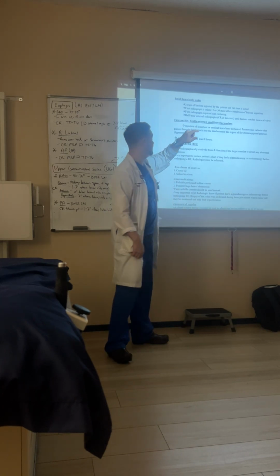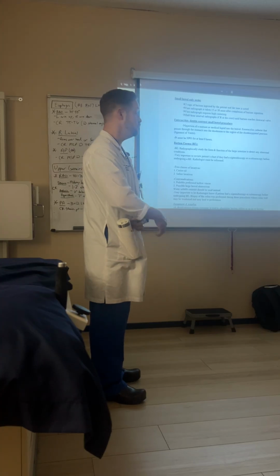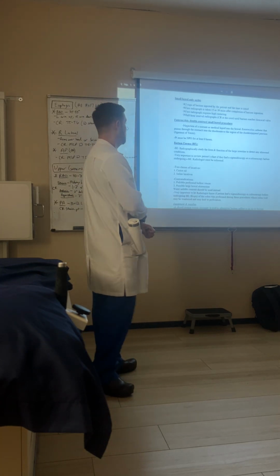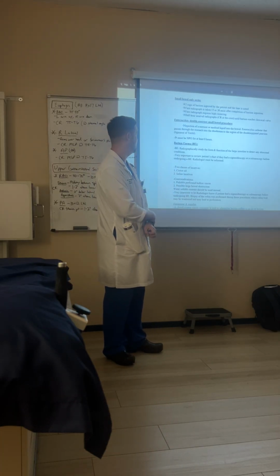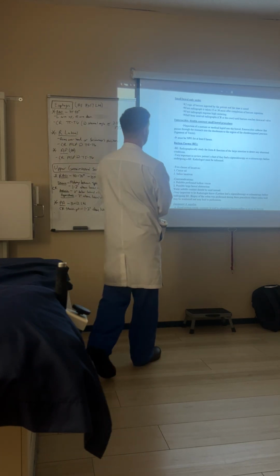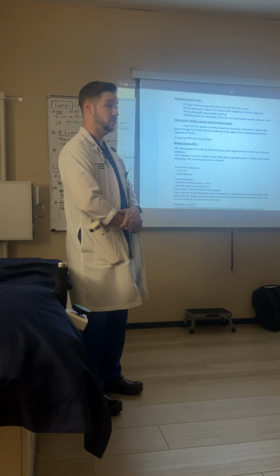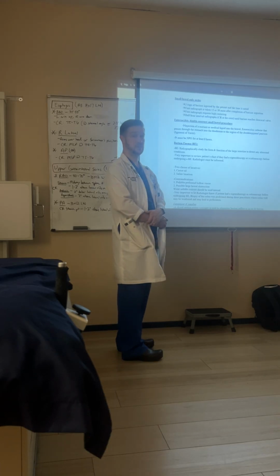Radiographs. Got it. Enteroclysis, double contrast small bowel procedure. We actually place a tube through their nose all the way, well, it doesn't necessarily have to be through their nose, but we place a tube through the stomach into the duodenum to the region of the duodenojejunal junction. I knew I was going to trip up on that. The duodenojejunal junction is held in place by something called the ligament of Treitz. Okay? Basically what we're doing is bypassing having the patient drink or eat anything, and we're just injecting the contrast directly into their small bowel. Patient still needs to be NPO for at least 8 hours for that procedure. Okay?